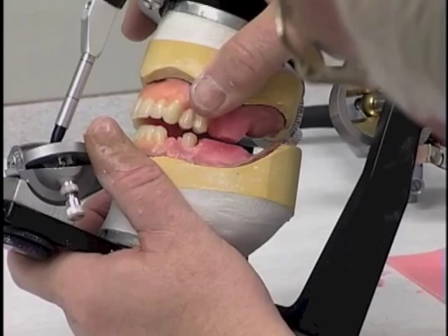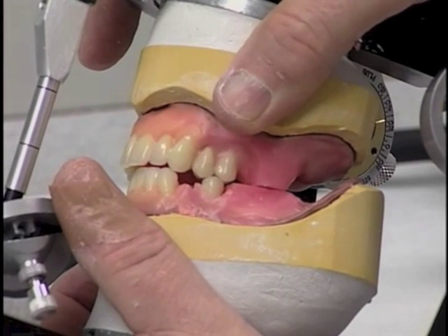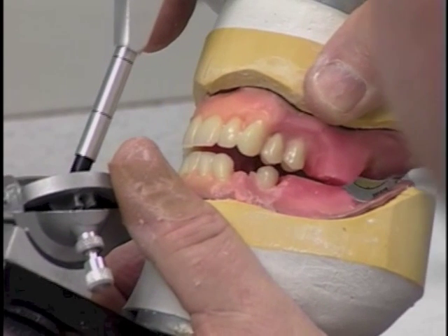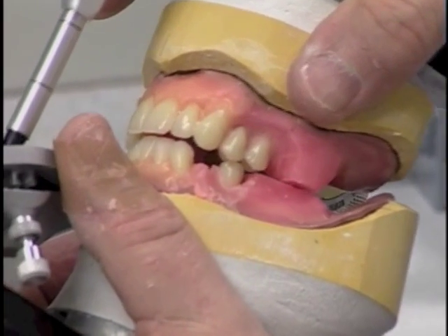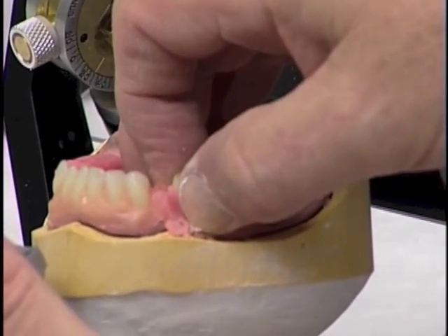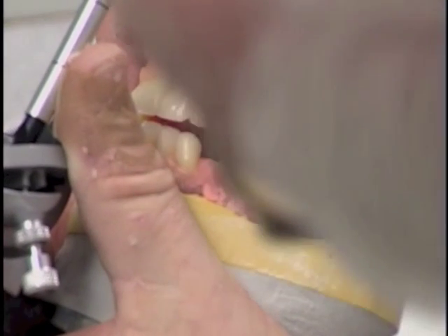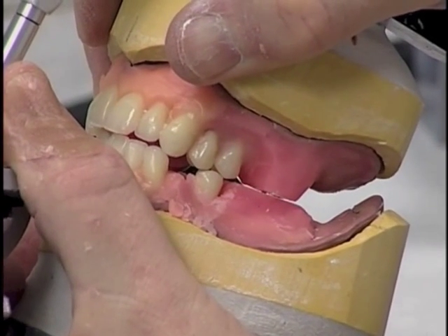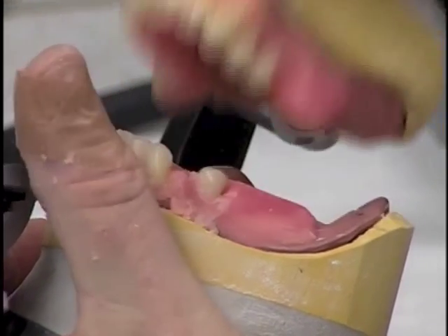Let's see what's happening now. Now, there we go. Now, we're still maintaining that relationship of the slopes of the mandibular with the slopes of the maxillary, and we're much, much closer on balancing relation now. It's within about 1/4 millimeter, it appears. It's getting very close. So let's see if we manipulate it just a tad more, what happens here. I like the relationship when we go into working this way, but in non-working, it's just a tad off.